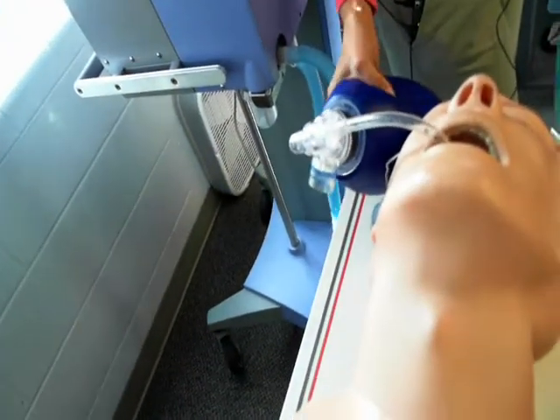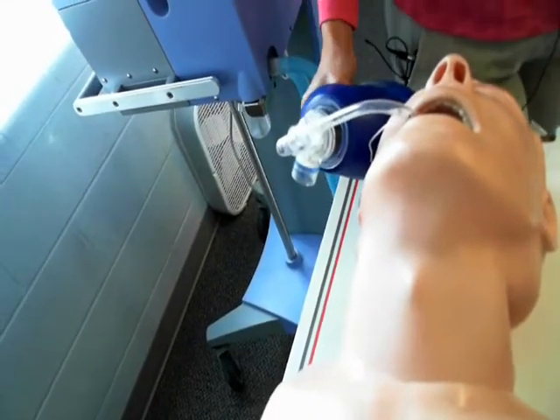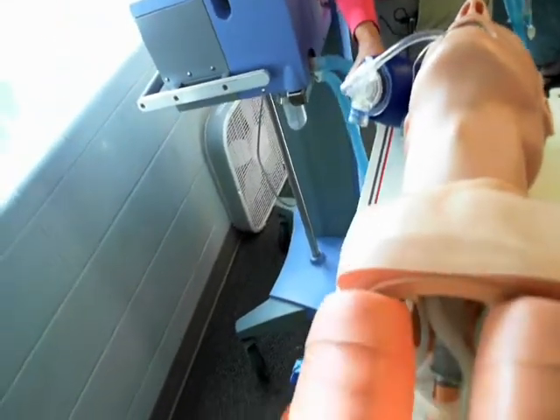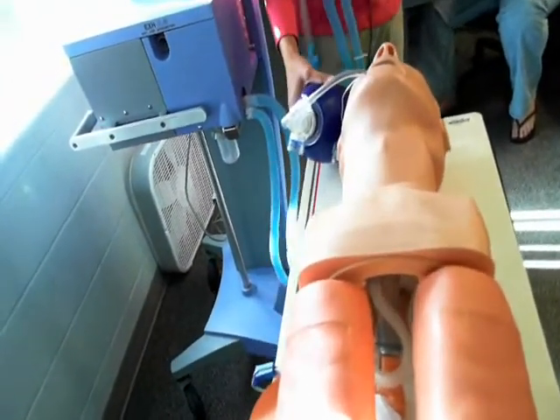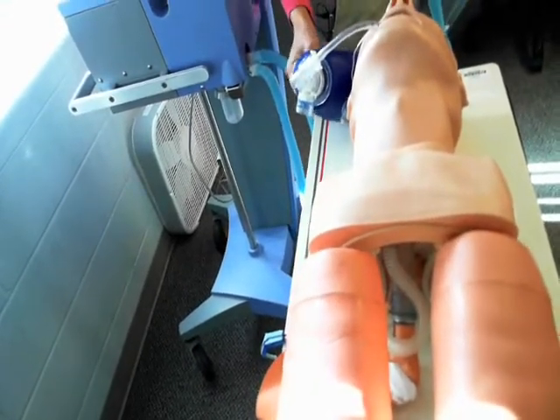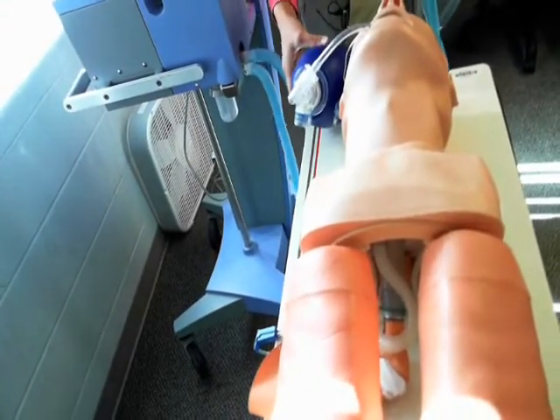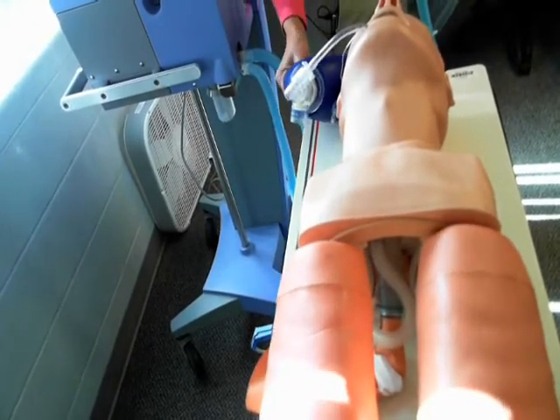You know, that's a good point, because that's just natural for me. But yes, you have to squeeze it. You know what you need to do? You need to breathe. Because oftentimes what happens is you forget to breathe. So if you need to breathe, your patient needs to breathe. You ambu bag them and you call for some help.